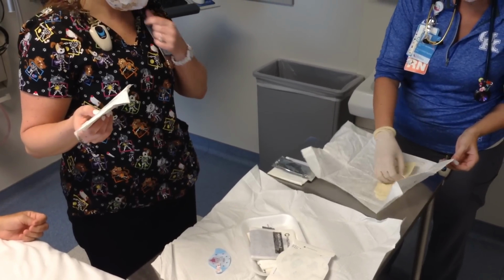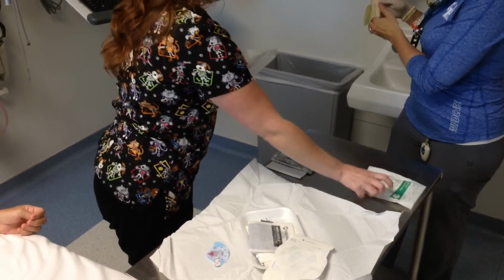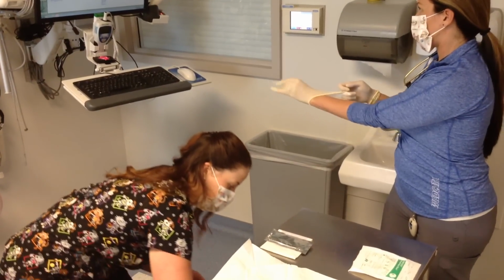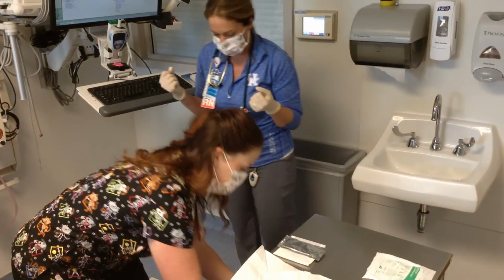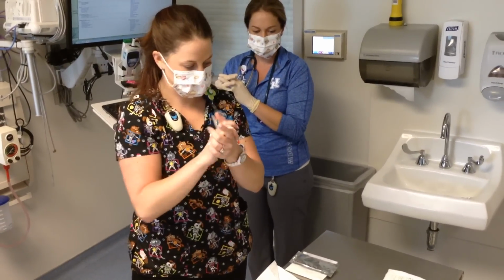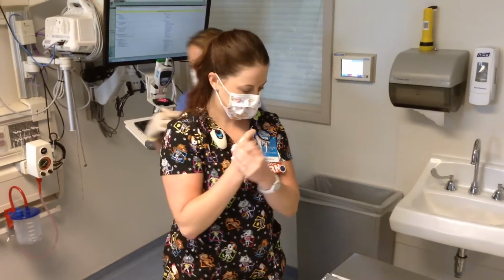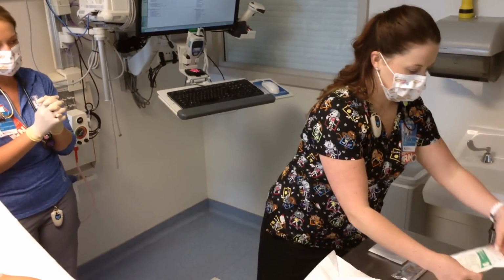So now you want to perform hand hygiene again and put on sterile gloves from the outside the kit. I'll always make sure that I have hand sanitizer. And you'll notice too that Renee's helper Kelly is putting on sterile gloves after performing hand hygiene, and she's going to use a sterile finger to help hold the PICC in place once the dressing's removed.